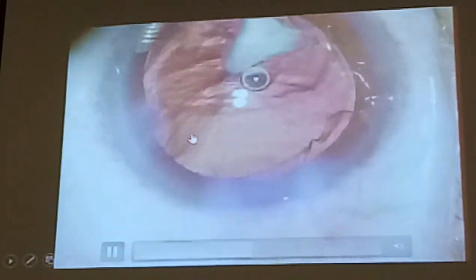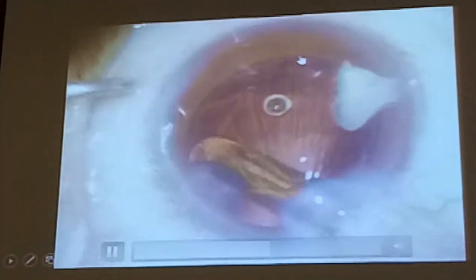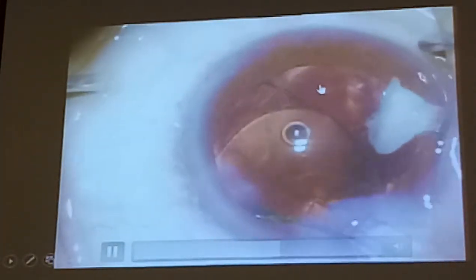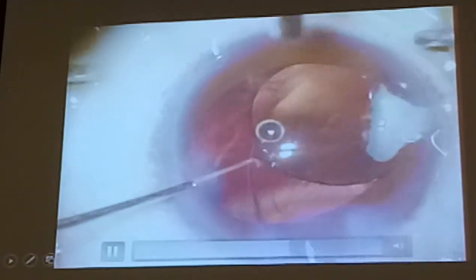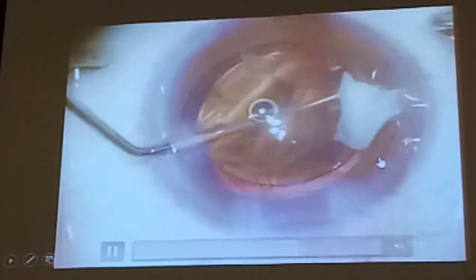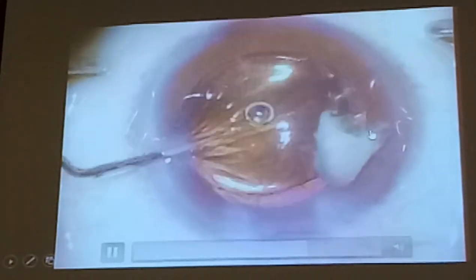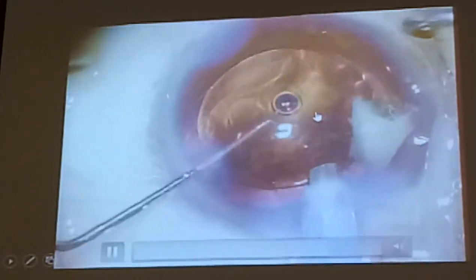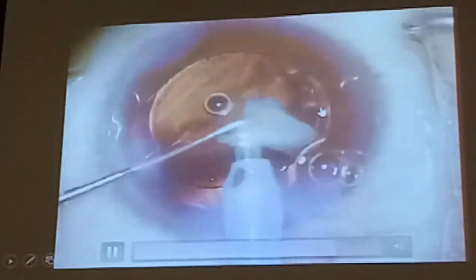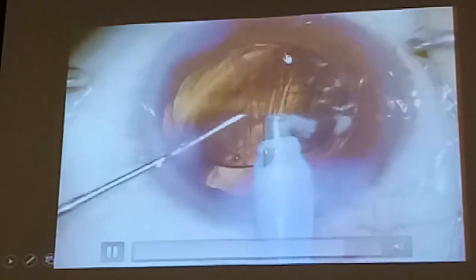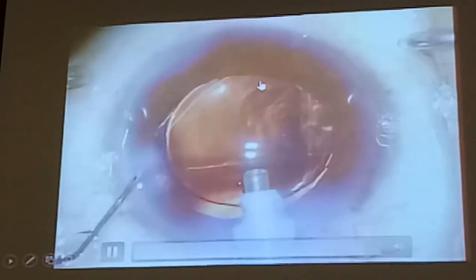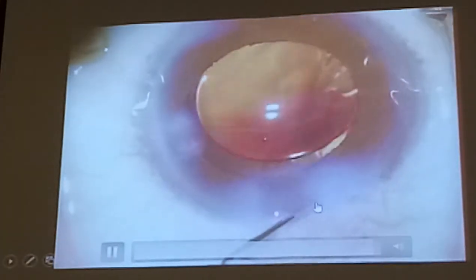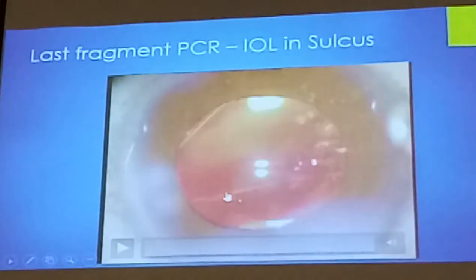My infusion is on so I don't have to worry. When I come out, this infusion is maintaining the chamber. Then we have this last fragment — you could remove it with visco, or you can just put the lens into the sulcus. In fact, if you wanted to, even into the capsular bag with a single piece, it wouldn't have adequate support. So this is in the sulcus. Then you can do an optic capture with good centered vitreous. Then you can put in the visco and lower the parameters, just slowly remove this last fragment. Make sure you keep the I/A at the center, staying over the center IOL so you don't aspirate any vitreous. Hydrate everything before it comes out.